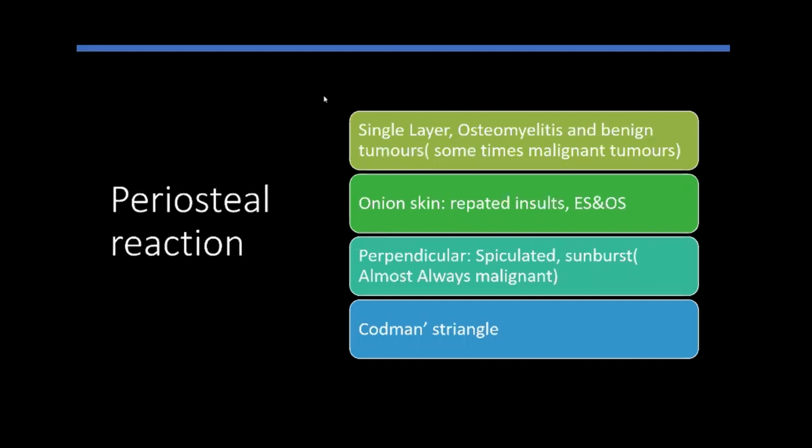You have these relatively slower tumors, so there is malignant activity, then because it is slow, there is some time for healing. There is a healing sclerotic layer, then malignant activity, then another boost for healing like that. So when it is a bit slow tumor, this will come with onion peel, onion skin appearance.